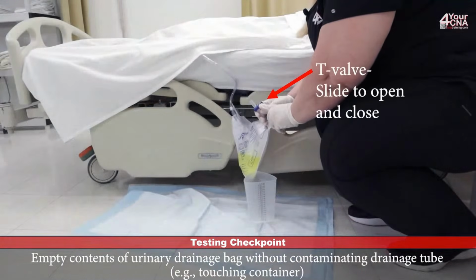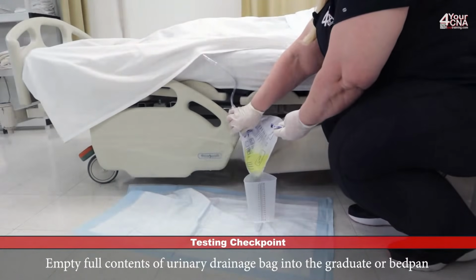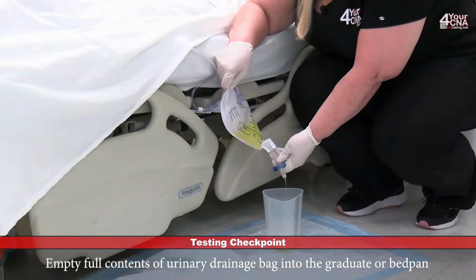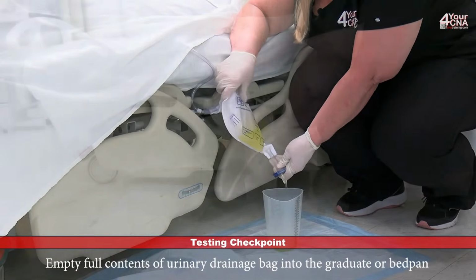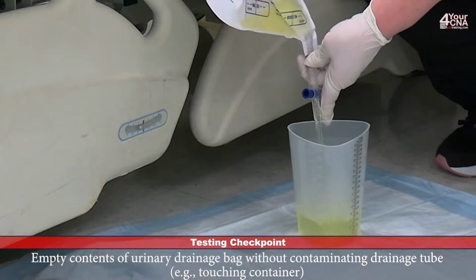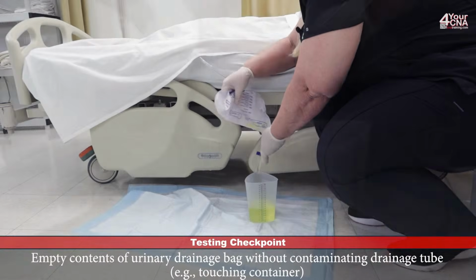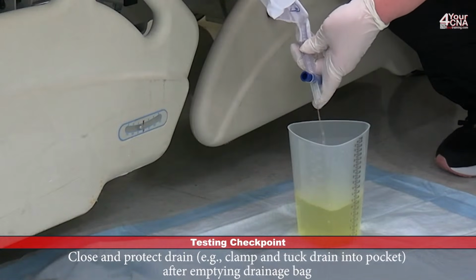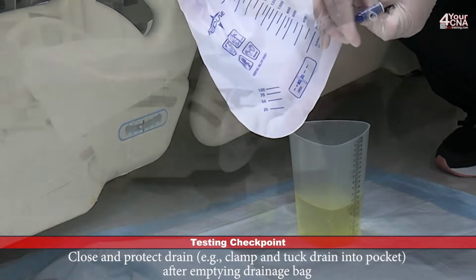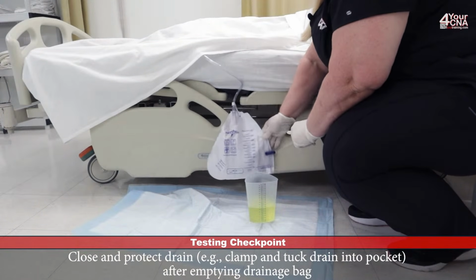This is a T-valve. We slide it to the side to open the valve, and then we're going to empty the urine into the graduate container without letting that port touch anything. Once the bag is empty, we'll close the port and place it back in its little house.